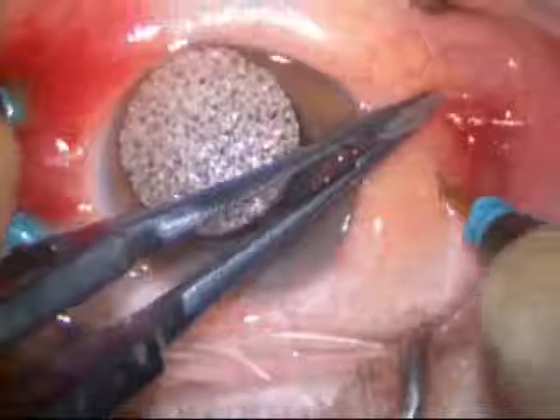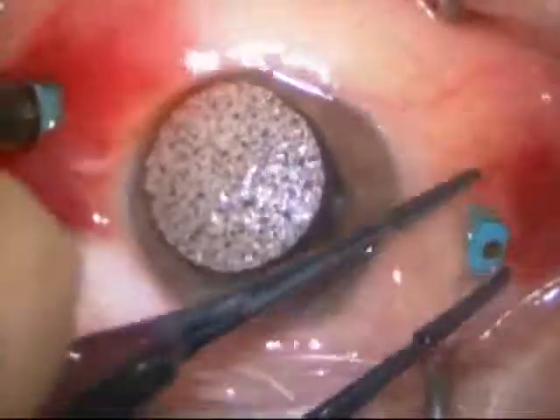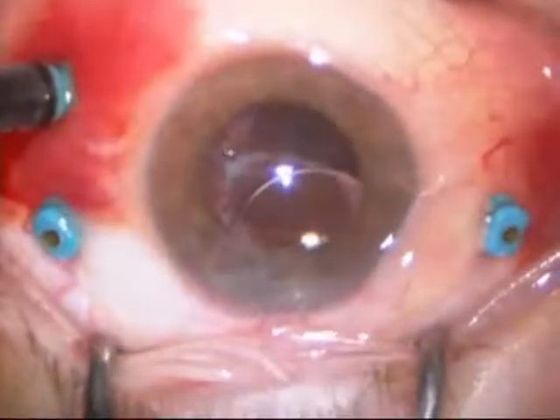This surgery is being done under local anesthesia. The patient is totally comfortable throughout the procedure. Also, this has been extensively edited — this was about a one-hour surgery.